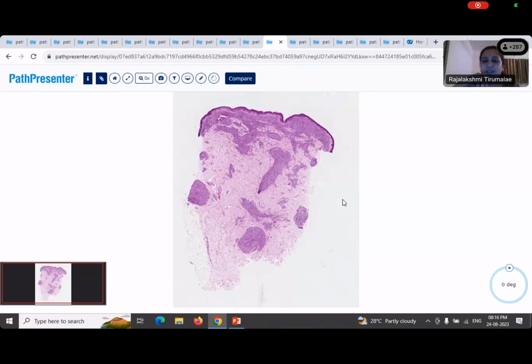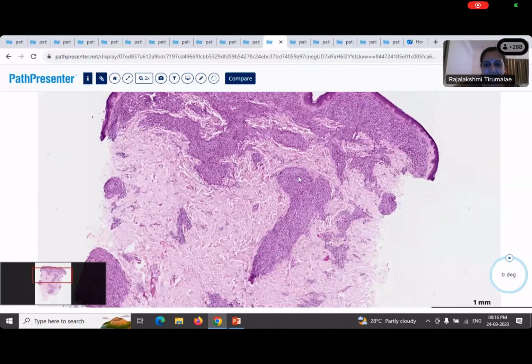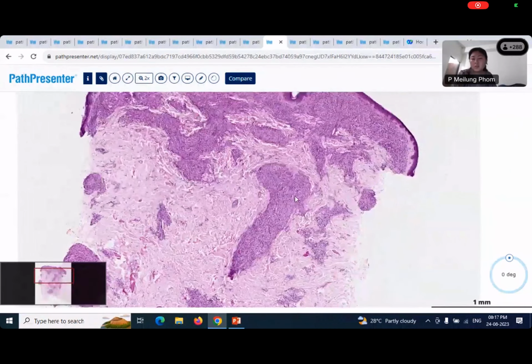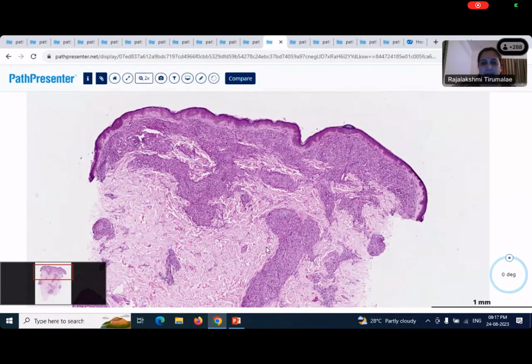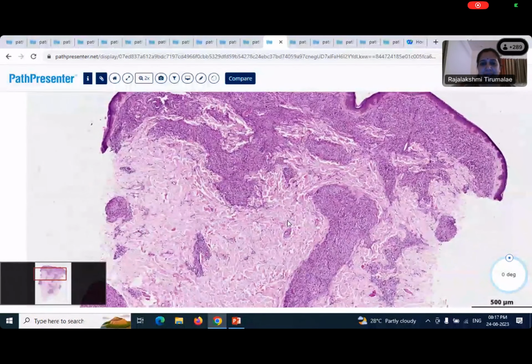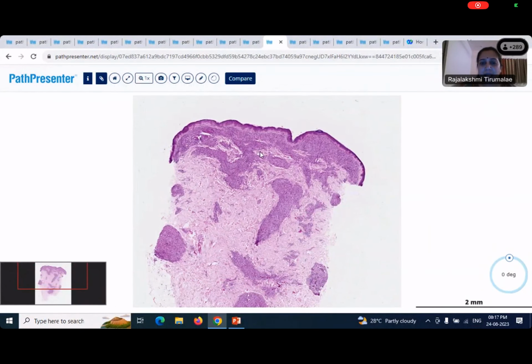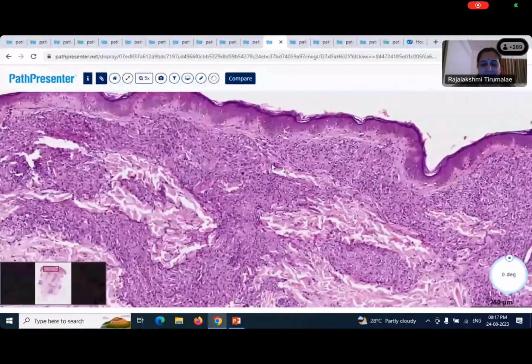Can you tell me what is the pattern that you're seeing here? It's a nodular pattern. Nodular, right? Because we're in the spectrum of nodular dermal infiltrates. Anything striking about this pattern? Isn't it very peculiar? Storiform, sort of. What is the term used to refer to this pattern? It is a nodular infiltrate. It's in a curvilinear pattern, isn't it? So these are oblong or curvilinear. There's a classical curvilinear pattern.